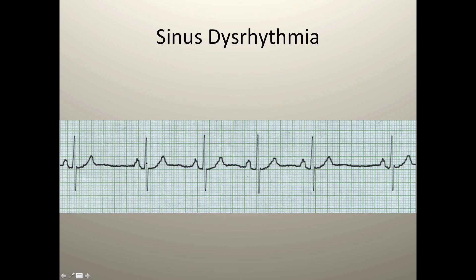Looking at this rhythm: before each QRS complex there's a P wave — one P wave followed by one QRS complex throughout the tracing. For the PR interval using one representative beat: about three to three and a half small boxes, so right around 120 to 140 milliseconds, absolutely within the normal range. For QRS duration: two small boxes — 80 milliseconds, which is a normal time interval for depolarization of the ventricles.